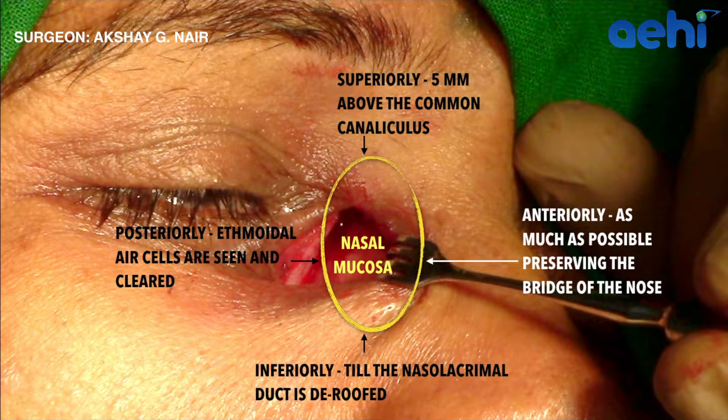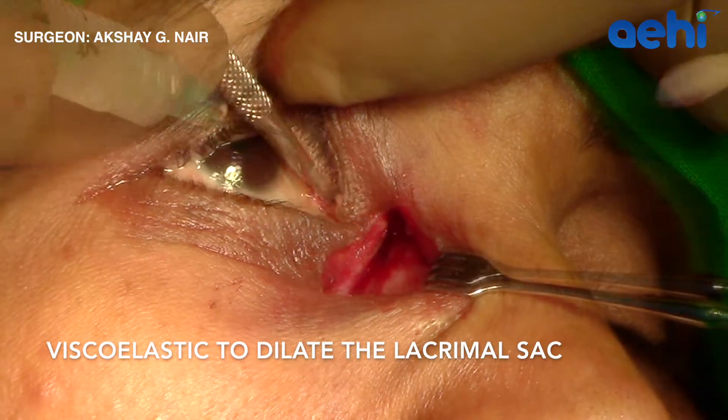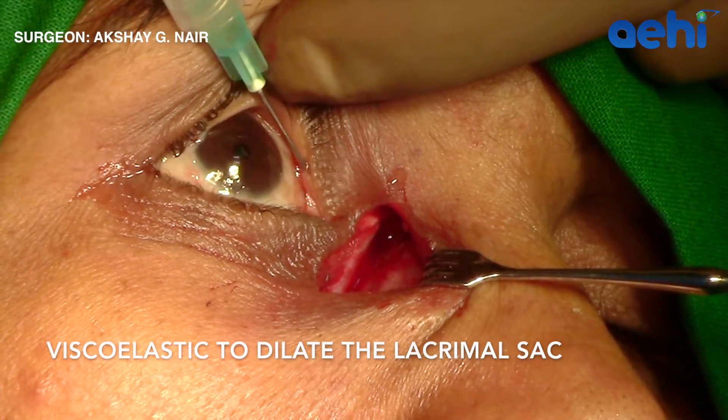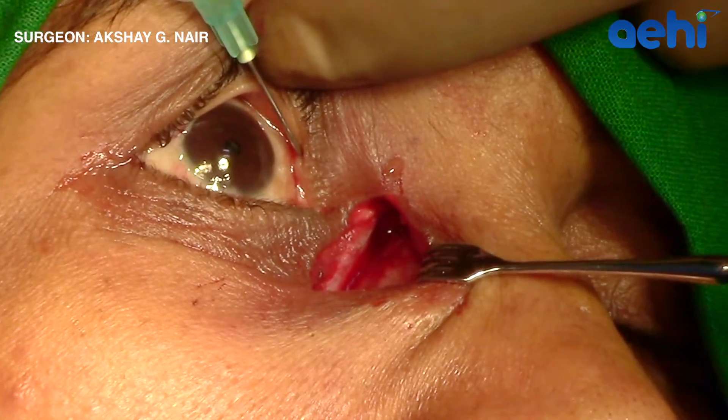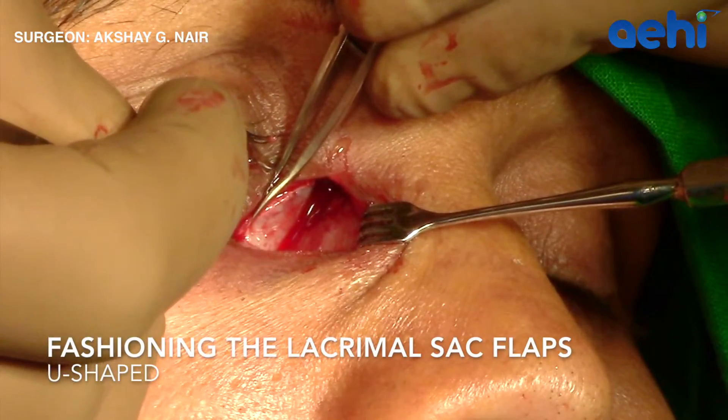That leaves a large patch of nasal mucosa with which a flap can be made. I prefer to inject viscoelastic material into the lacrimal sac, which allows for easy flap creation. Here you can see the lacrimal sac enlarging with the viscoelastic material.